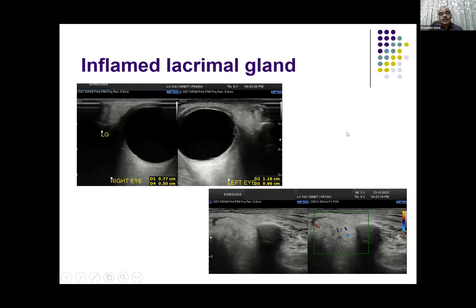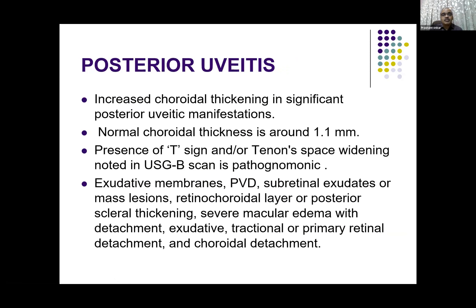Sometimes the cause of pain and redness is outside the globe, and this is also very well picked up by ultrasound. In this case, on the right side the lacrimal gland is normal, but on the left side you can see that it is bulkier than the right side and shows a good amount of vascularity. This is picked up when the clinical features are not very specific.